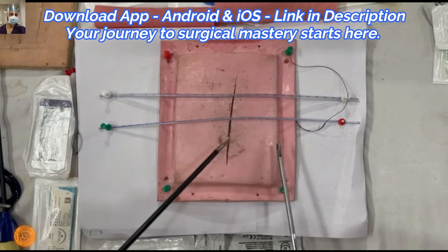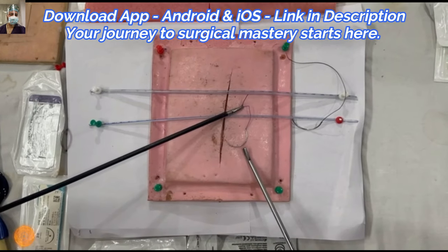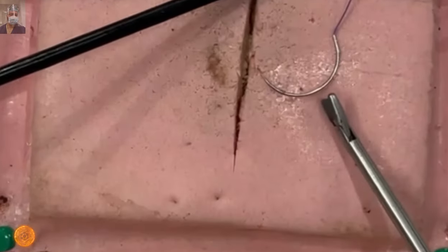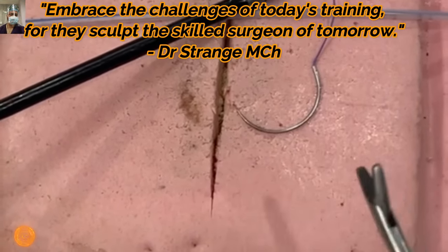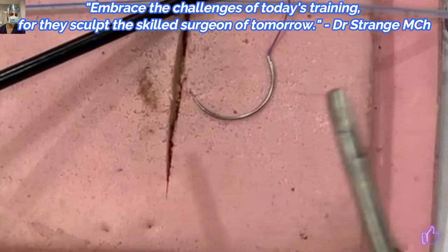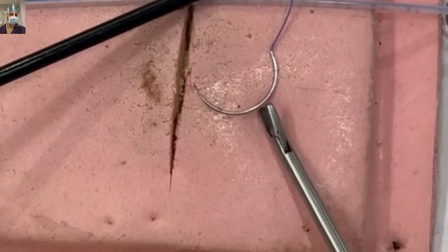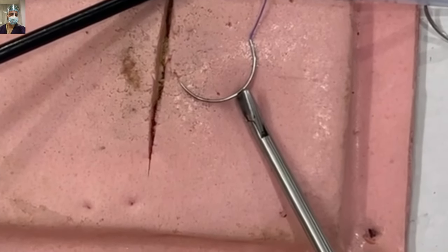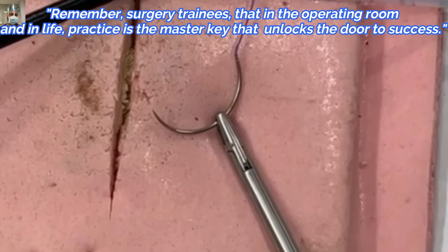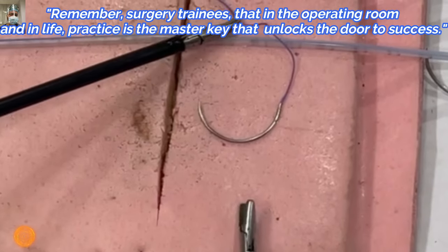The simple technique I am showcasing here is that you just drop the needle on the viscera and then approach the needle at approximately 90 degrees at the 50th percentile of its circumference — so half the length is ahead and half the length is toward the swage end, with the tip pointing forward. This is different from open surgery where we follow a two-thirds/one-third rule. You then approach with the static limb of the needle holder pressing the viscera, and the active limb — which is opening — is above. As you approach and press, you gradually start holding the needle as close to the tip as possible.